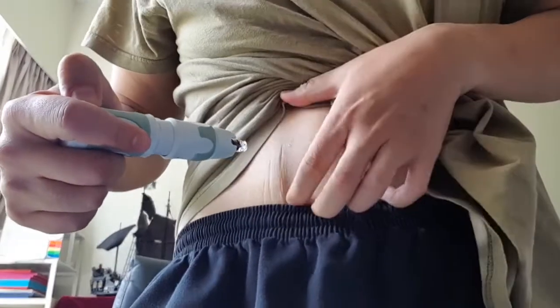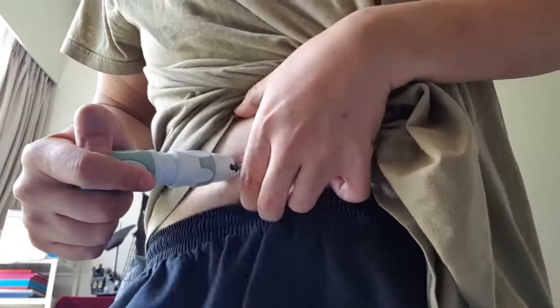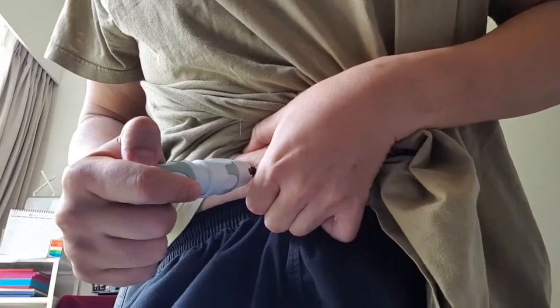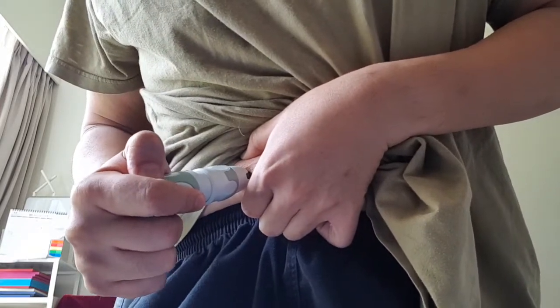What I usually do: pinch a bit and then just shoot. Just press and shoot. Literally there's no pain and you hold it for about 1, 2, 3, 4, 5 seconds.